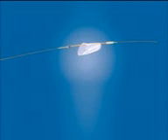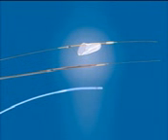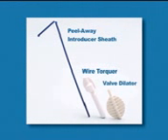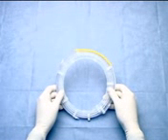Product preparation. The Filter Wire EZ system is comprised of 1 protection wire with incorporated filtration system, 1 peel-away EZ delivery sheath, 1 EZ soft-tip retrieval sheath, 1 accessory kit containing 1 peel-away introducer sheath, 1 wire torquer, and 1 valve dilator. The preloaded protection wire and EZ retrieval sheath come packaged in 2 attached protective coils.